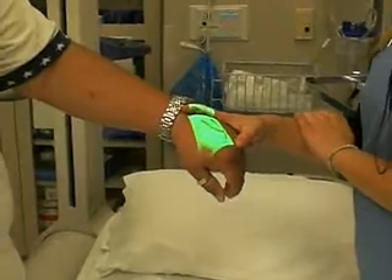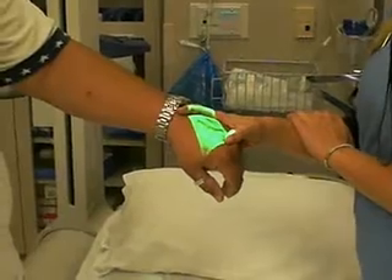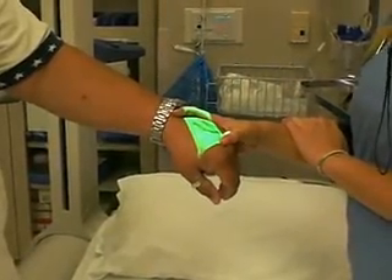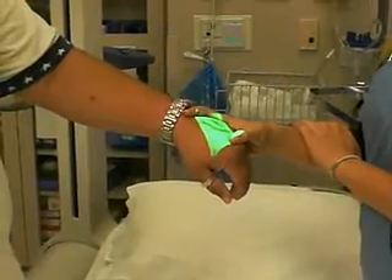A vein viewer costs $29,900 — so about $30,000. Fabulous. Wow, that is unbelievable. Isn't that crazy? That is.